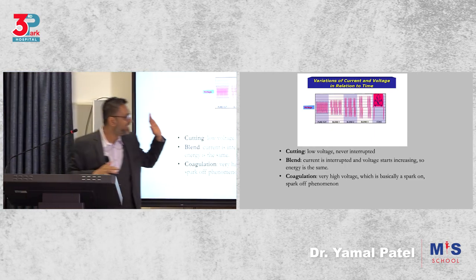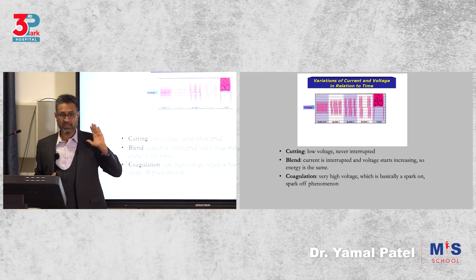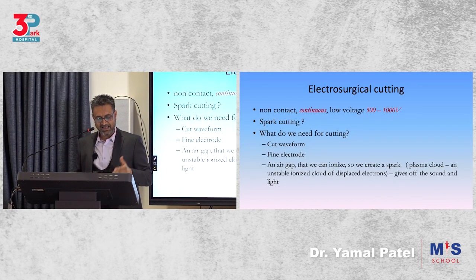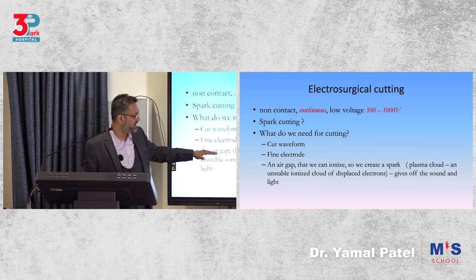So you don't go there if you don't have to. You stick to these sides more, okay? So this is about energy. So cutting should be non-contact, continuous. And what do we need for cutting? A cut waveform, fine electrode, and an air gap.